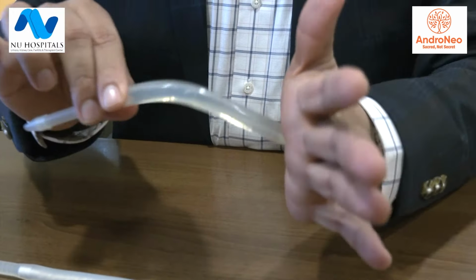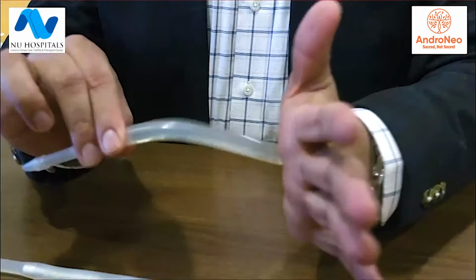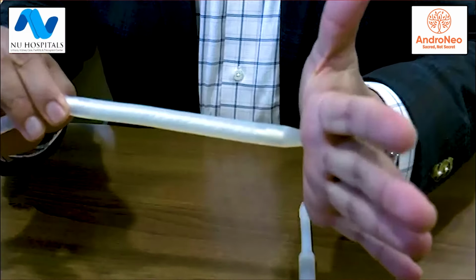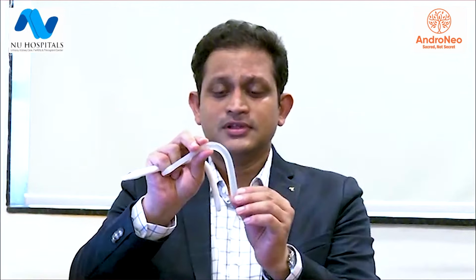So as you see here, in semi-rigid implants there are again different varieties. This is a simple silicone Indian implant which has no core inside. This is just a simple silicone implant. This is the Tactra from Boston Scientific. This has some amount of memory, so if you bend it, it retains some amount of bending. So this has a memory when you compare it with just a simple silicone implant. And this you see here is the Genesis implant, again from Coloplast, and this is the Tube from Promedon, which is a German company.